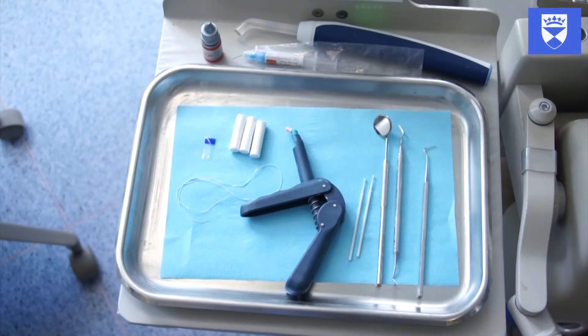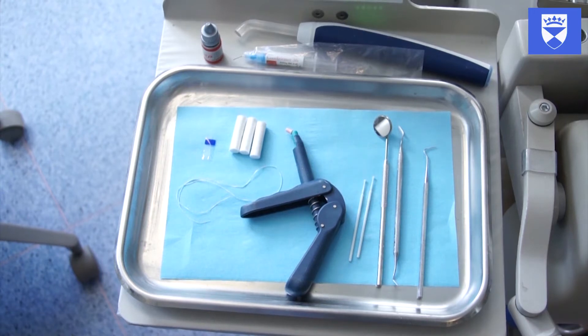This video demonstrates a predictable and reliable method of placing a composite bandage on a fractured central incisor. On the screen you can see a selection of materials and instruments that you may find useful in undertaking this procedure.